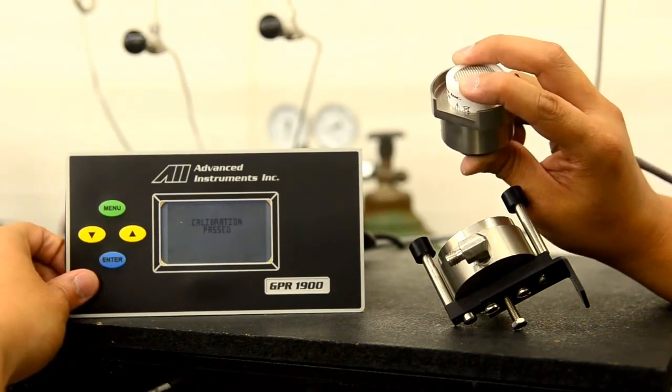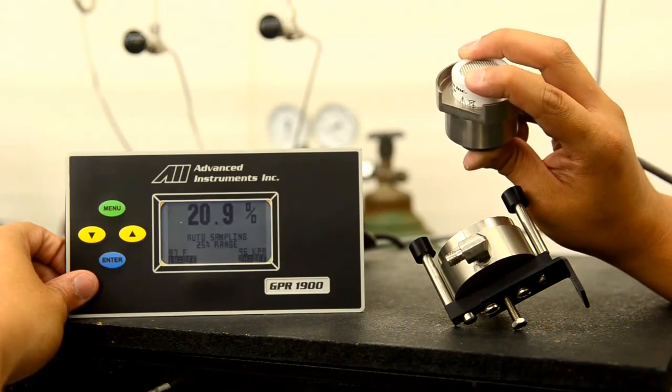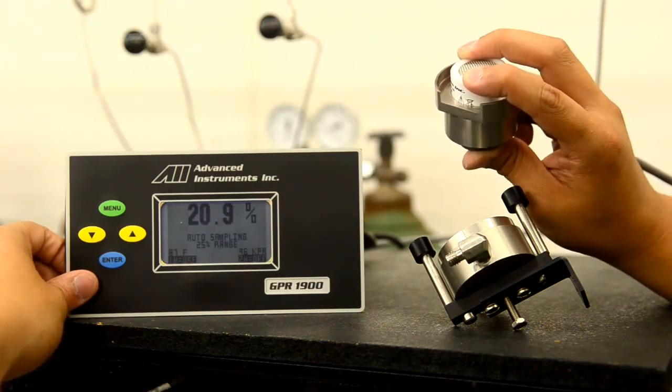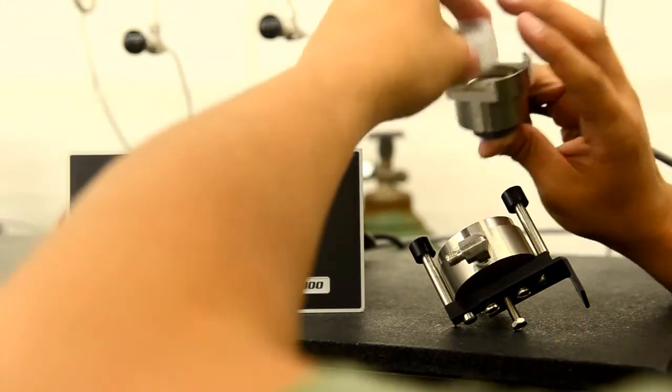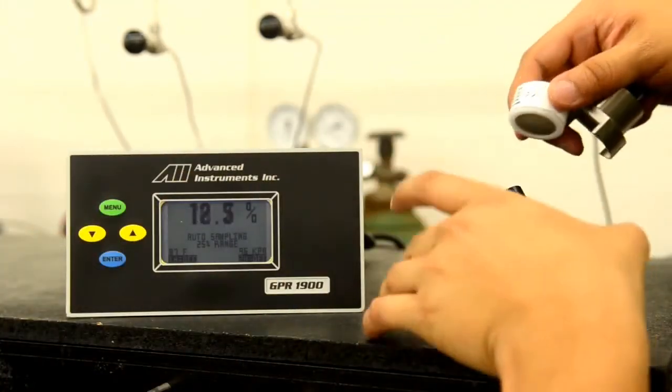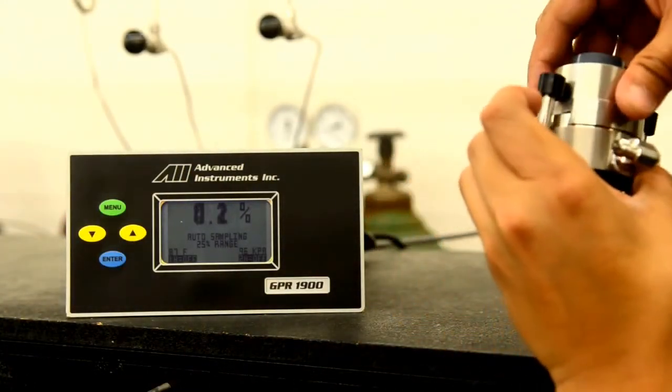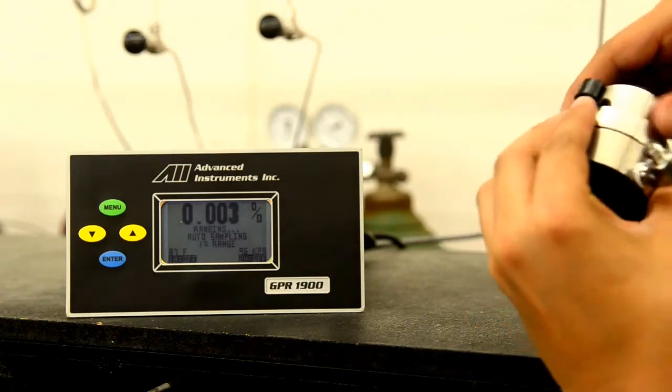Once that has been done, calibration pass menu will appear to ensure you that the sensor has calibrated to ambient air as seen at 20.9%. We will now remove the sensor and run it with nitrogen gas or zero gas as it is a PPM sensor.